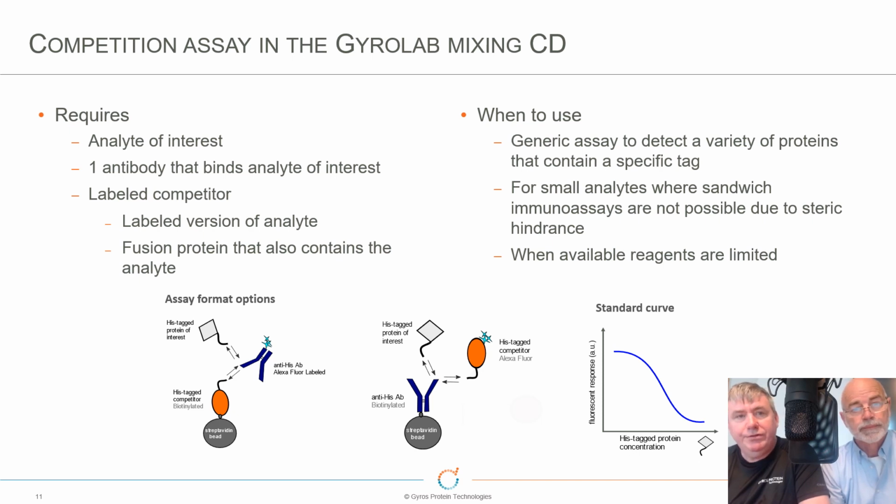So now moving on to competition assays, and it gives me great pleasure to discuss competition assays. I started my career many years ago doing radio immunoassays, particularly analysing small molecules. Small molecules are now mainly done by LCMS, but it's nice to see that small molecules can be done in the Gyrolab format. I'm a big fan of the mixing CD in particular, and this is another use of the mixing CD outside the normal use of it for ADA assays for acid dissociation.